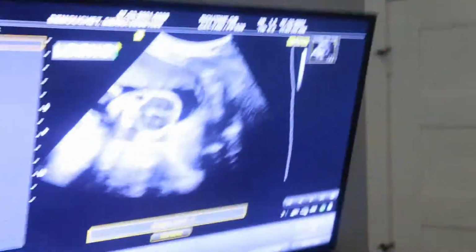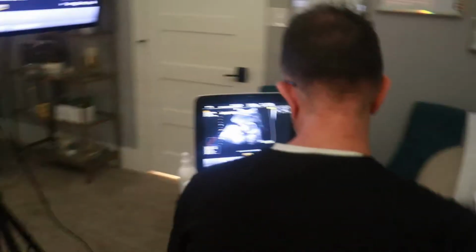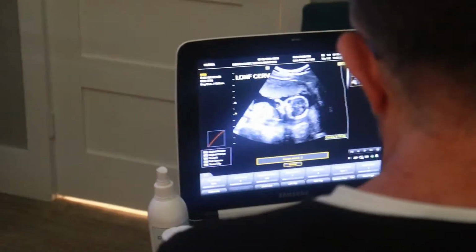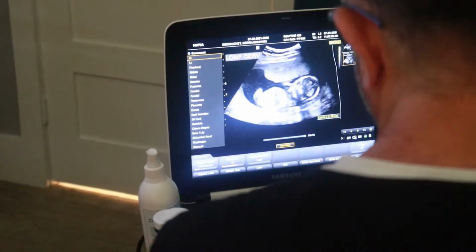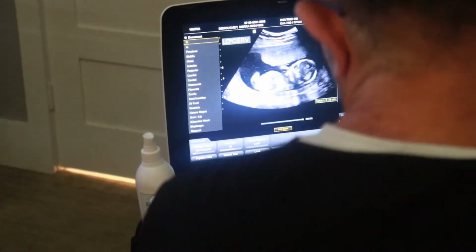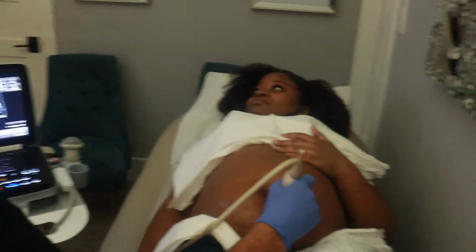Starting with the lower uterus. Yours is an anterior, which means the placenta is on the front of the uterus. You see it right there, that little thicker gray area. That's where the baby gets the nutrients from. Baby is head down today. They either lay with their head up or their head down. Head's right down here, and that little behind is more up here by the top.